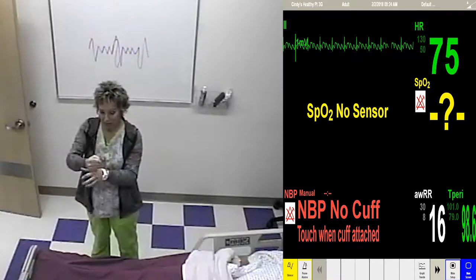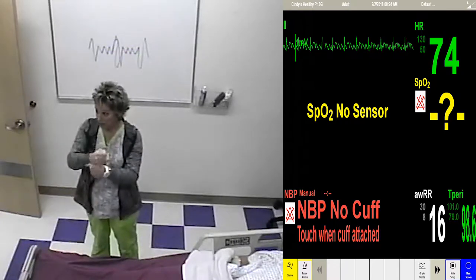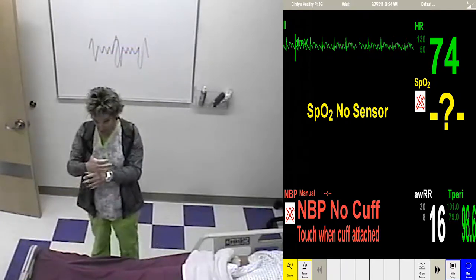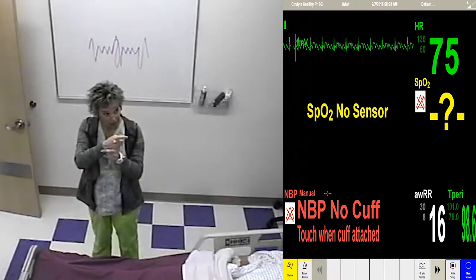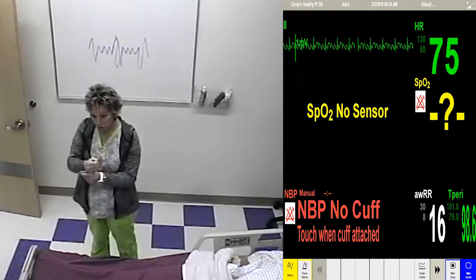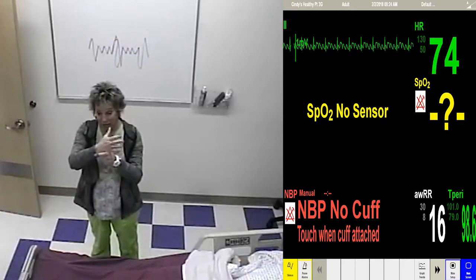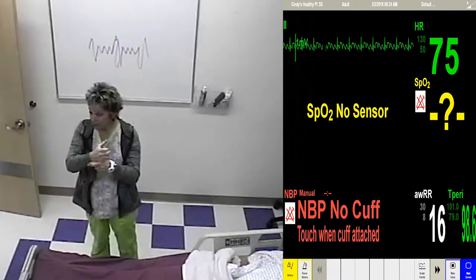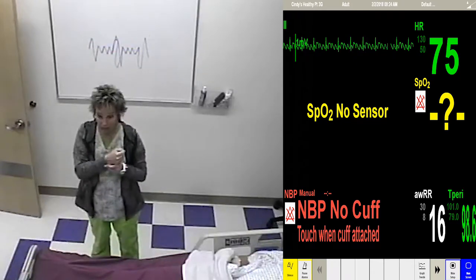Okay. So when your heart is pumping, it's P, QRS, T. P, QRS, T. In this case, because our rhythm's regular, your ventricle is pumping along just fine. Your atrium, it is pumping, but too many times in between. Okay? Yeah, that's exactly right.